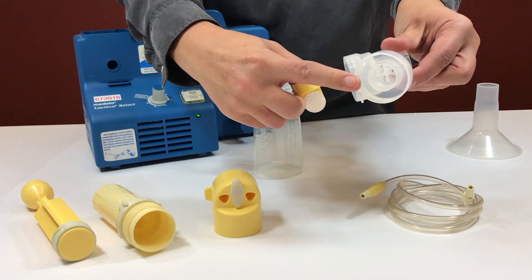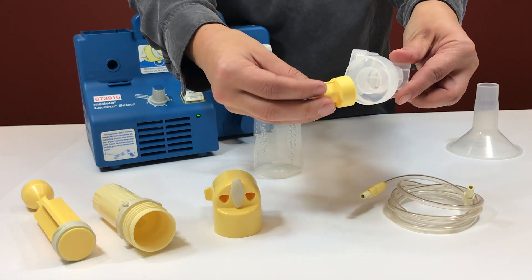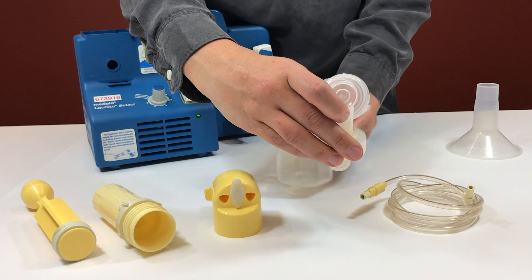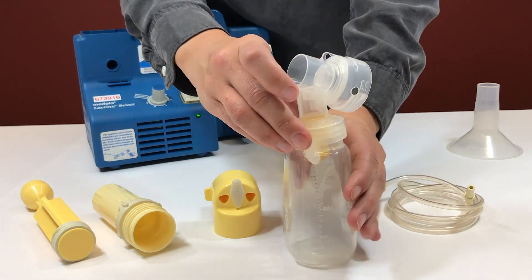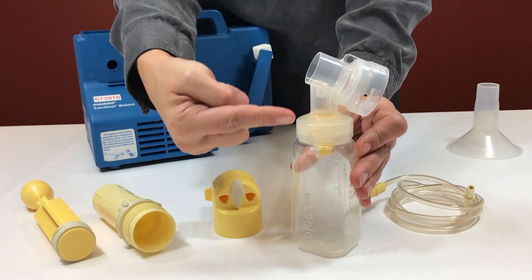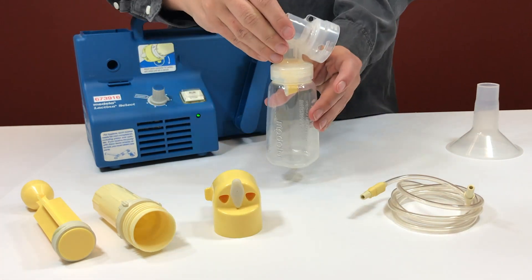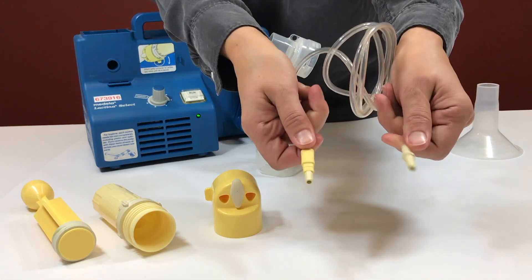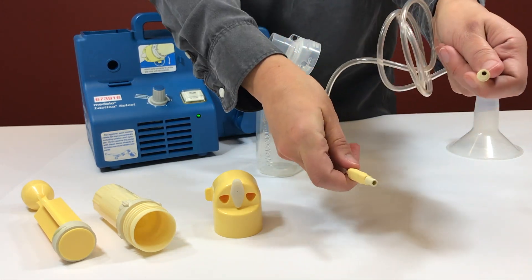Take the connector and screw it on the bottom. Insert the tubing in the connector. Tubing has two ends — the circle ends go on the bottle connector.